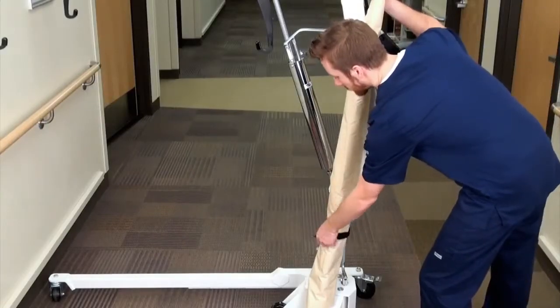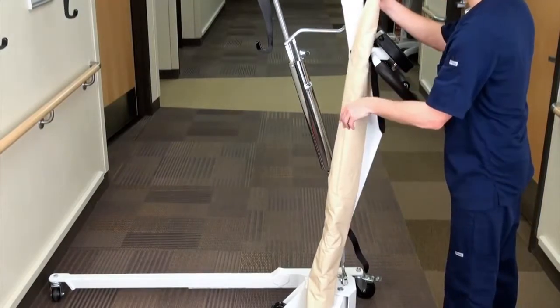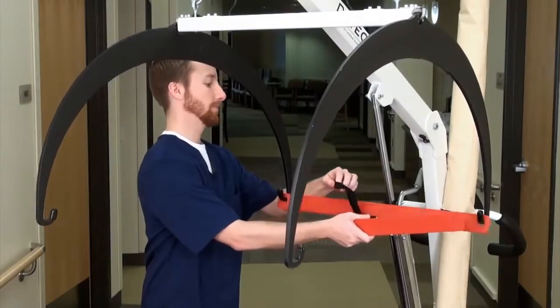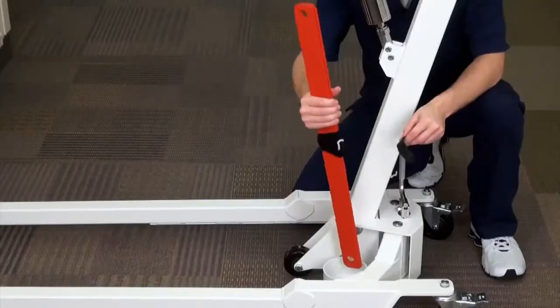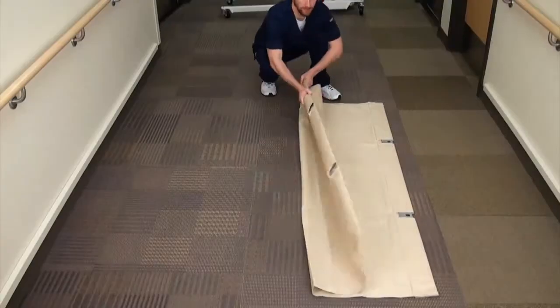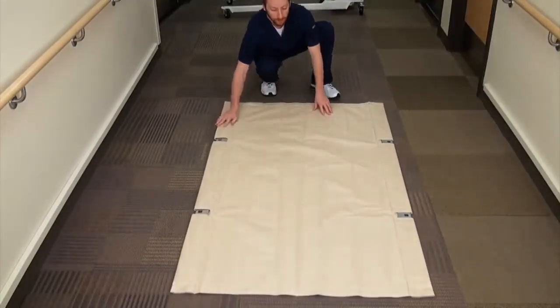Begin by undoing the Velcro straps holding the stretcher to the column. Next, remove the red transport bars from the support hoops. You can either set them aside or place them in the stretcher cup, attaching them to the column. Place the stretcher on a flat surface and unroll it.